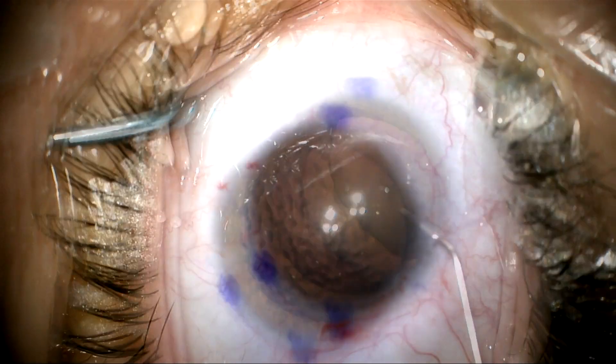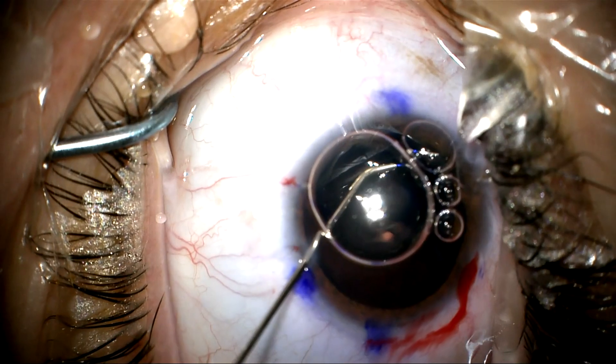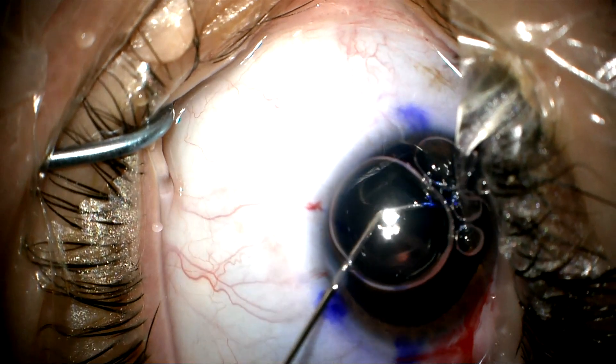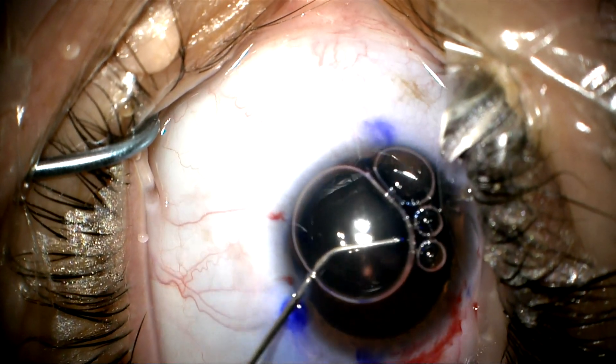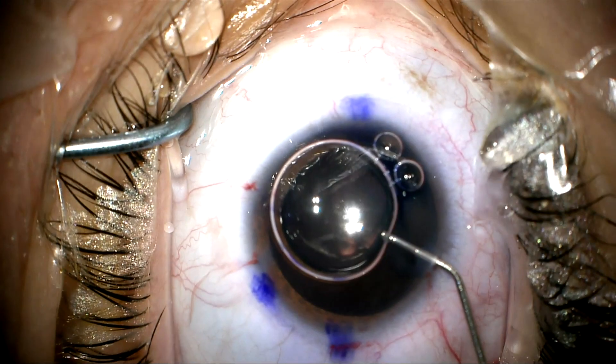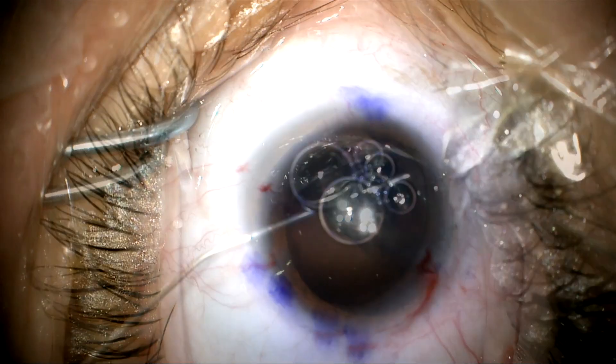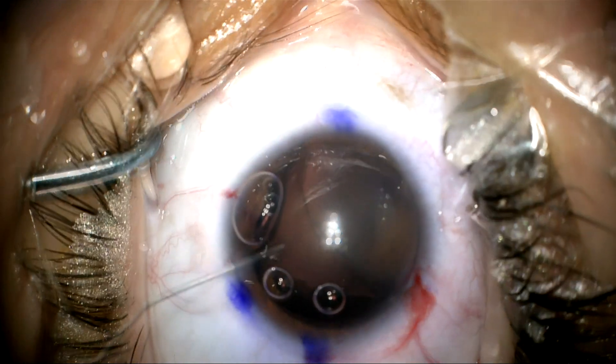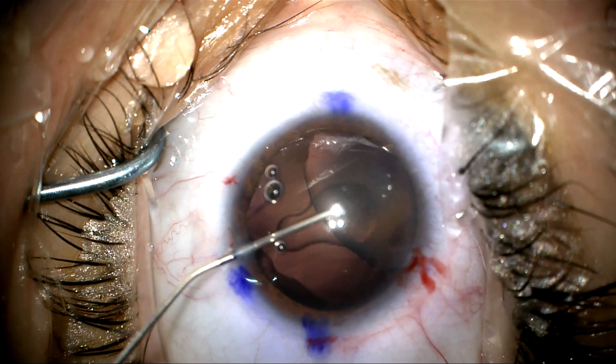Here we're using dispersive viscoelastic to cover the area that is exposed where the zonules are absent. We're going to use an air bubble to push that viscoelastic in place, compacted, while we stain with vision blue. The vision blue is dripped onto the surface of the lens capsule and provides a nice stain.